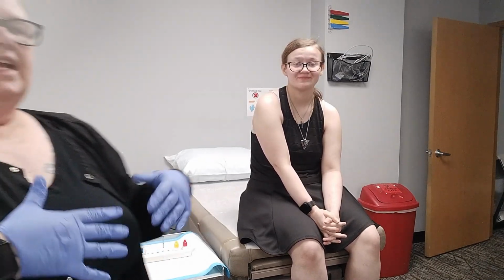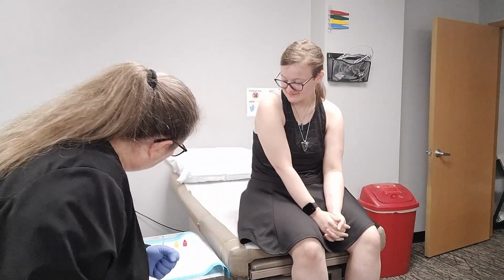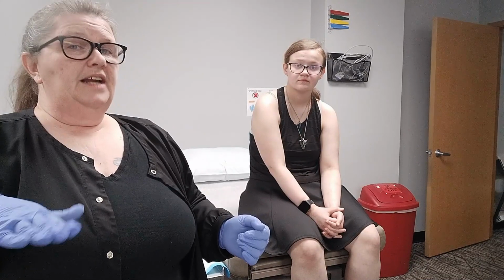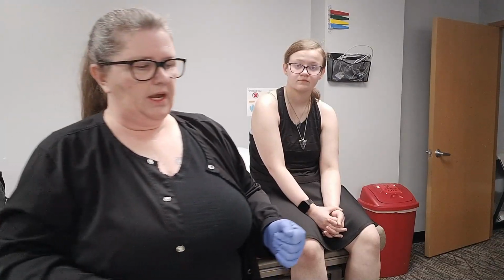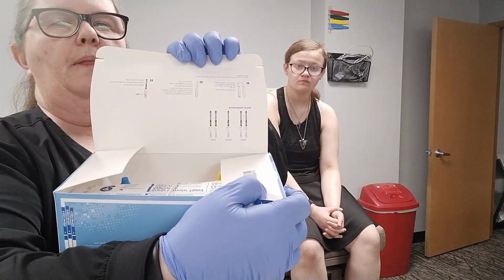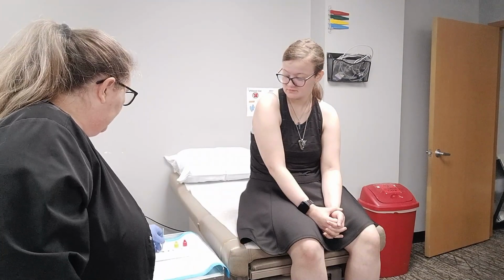Okay, so let us say that 5 minutes has elapsed. Actually, I'm going to give it just a couple more minutes because it has not fully gone up there, so I can show you what that looks like. But after 5 minutes, we're going to go ahead and take a read on it. If there is a line at the top but no line at the bottom, that is a negative. If there's a line at the top and the bottom, that is a positive. If there's a line at just the bottom and not the top, that is invalid. And if there's no lines, that is invalid. Okay. And you don't have to memorize that. It is right on the box. All right. We're going to go ahead and say that the 5 minutes has elapsed.